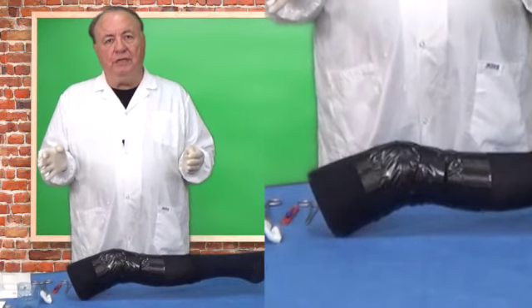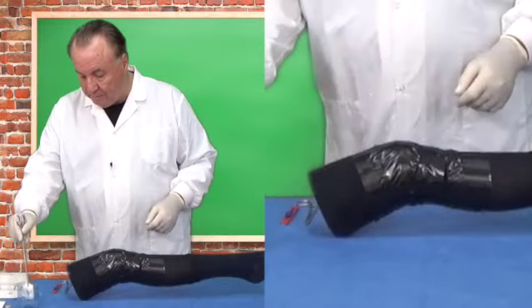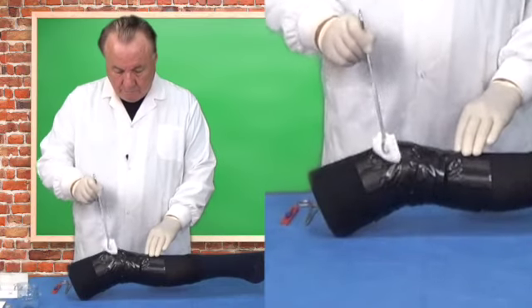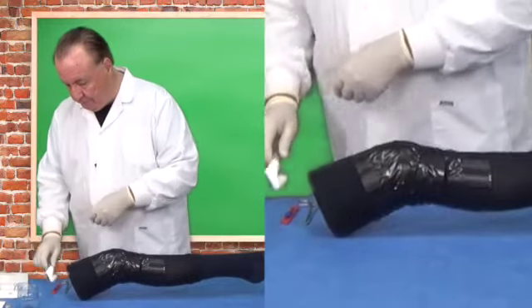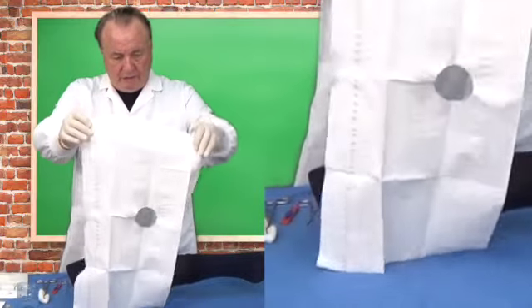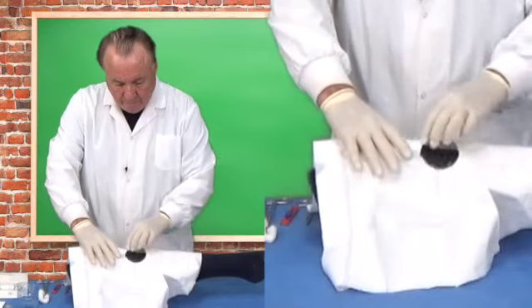Interosseous infusion is a sterile procedure. I'm wearing sterile gloves. I'll prepare the skin with sterile solution. We have a fenestrated drape to keep the procedure sterile.